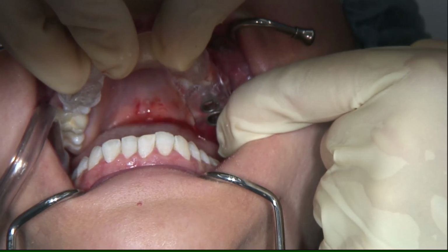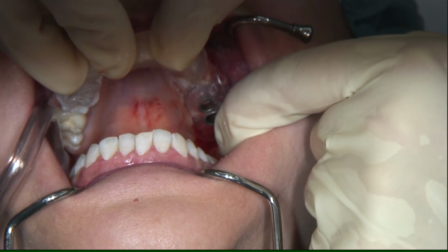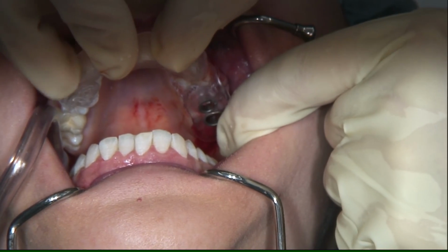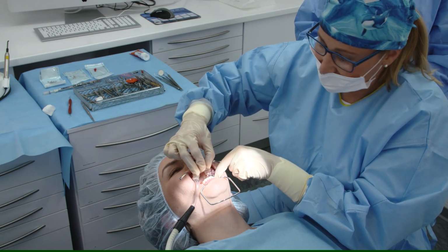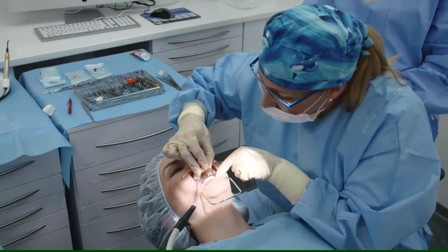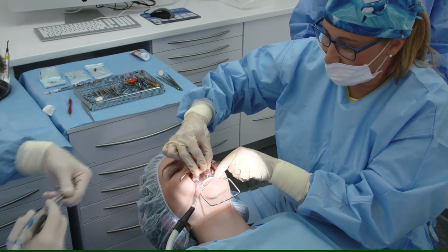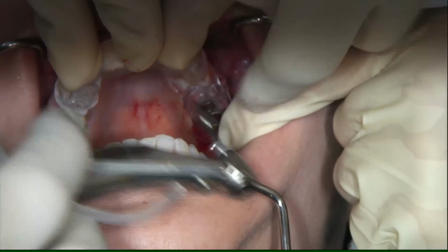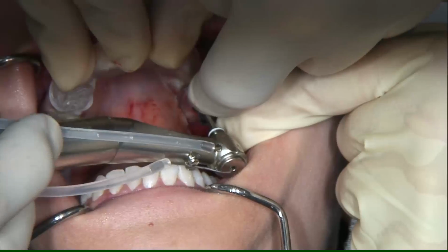The distance between the two implants should not be below 3 millimeters. We know this from studies from Tano, very famous studies that show that the distance between two implants should not be below 3 millimeters, and from implant to tooth not less than 1.5 to 2 millimeters.